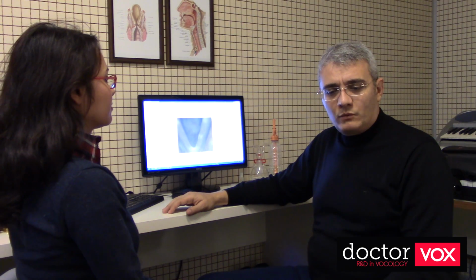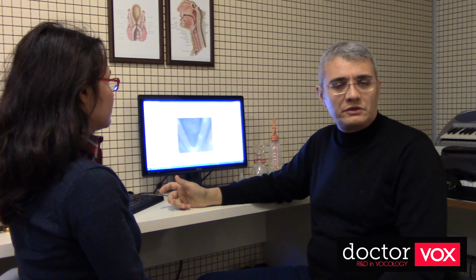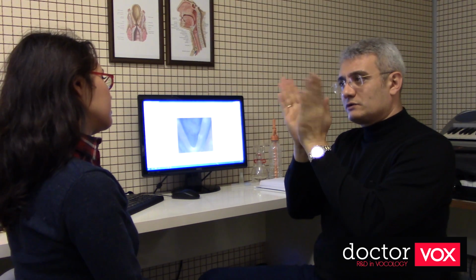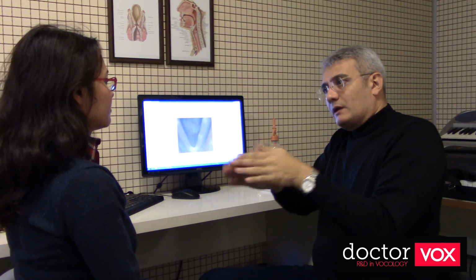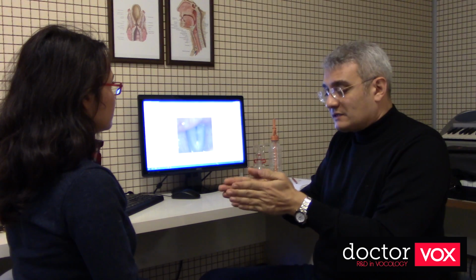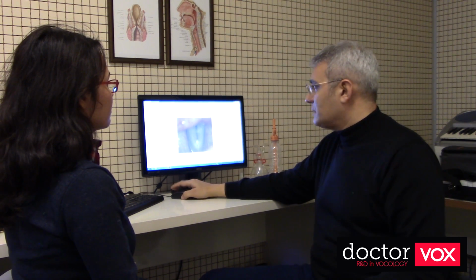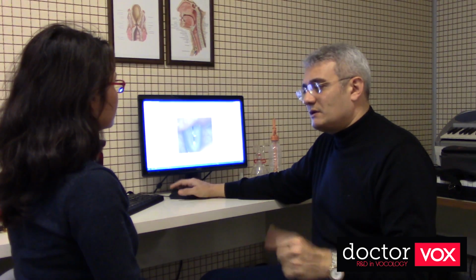In the counseling step, we let the patient see her vocal folds in action by stroboscopic recordings. You can also use some slides, some pictures, or you may draw by yourself. So these are your vocal folds, and there are 2 vocal folds here, and they open and close like that. When you phonate, the vocal folds vibrate like the lips, and they make sounds. But your vocal folds do not vibrate and impact totally, but in the middle. So you have little bumps in the middle of your vocal folds, but this is not so important and can be corrected quickly.